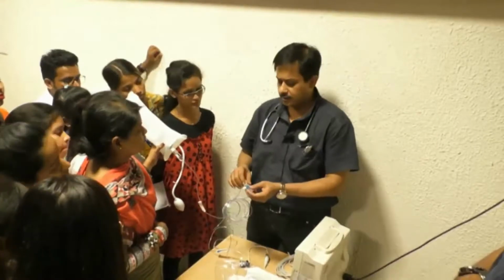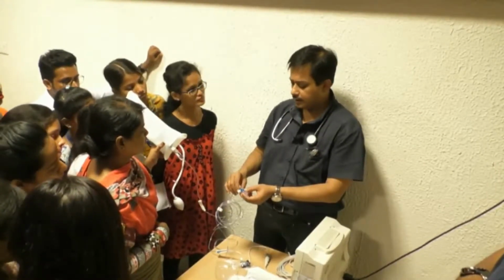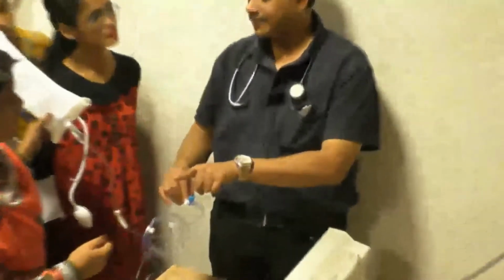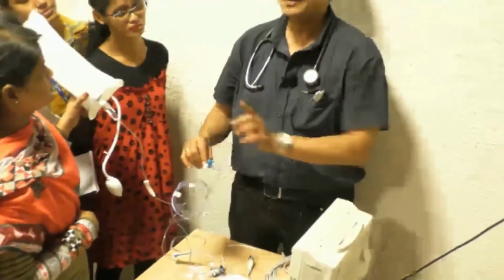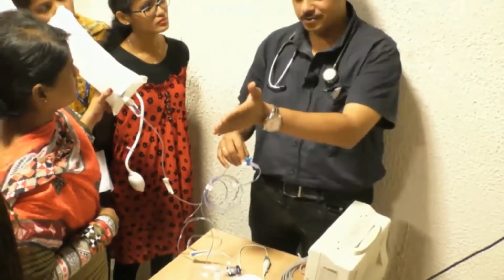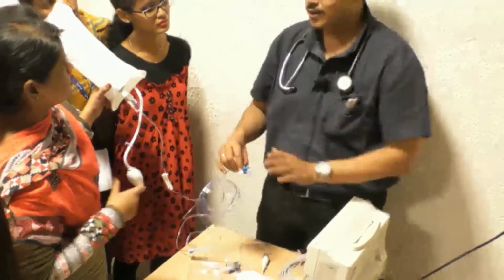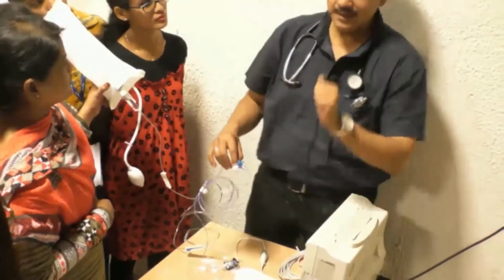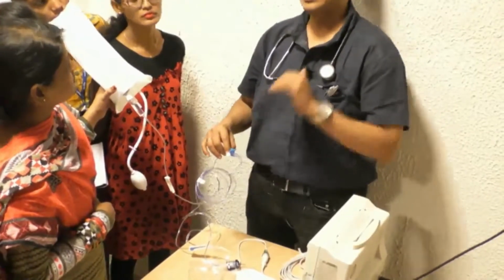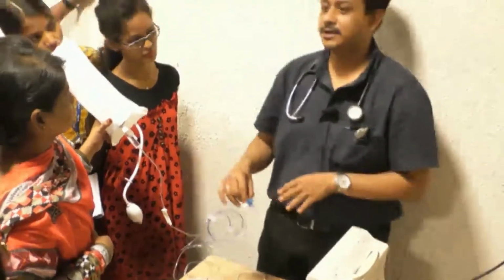Of infection. So after I have zeroed it, how do I zero it? I open it to the atmosphere. Why am I doing it? Because of the effect of atmospheric pressure, considering the atmospheric pressure and any other hydrostatic effect.